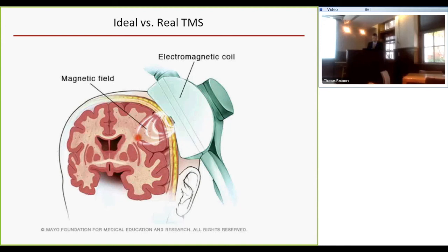And to optimize for TMS, we have to have an appreciation of real TMS rather than this idealized picture. So I here started adding and correcting this figure to emphasize what actually happens. So first of all, the strongest stimulation and activation happens in superficial brain regions because the field attenuates in depth. We can characterize that area of activation with some depth and spread, which gives you the overall focality of stimulation. But of course, it's not a beam, you have field around it that is weaker, but it still covers some extent, and there are probably subthreshold effects in these regions. Then within the target and also in the surrounding tissues, there are various neural populations that you may be affecting, right? And you may want to target just one of those.